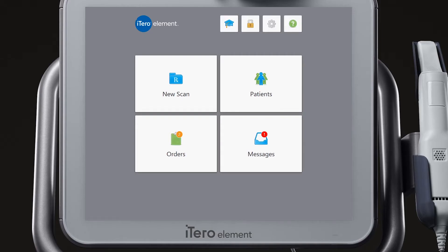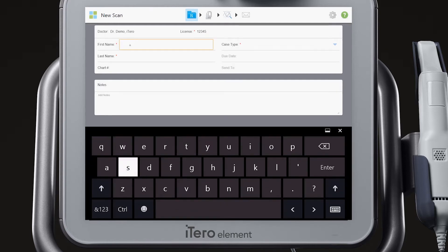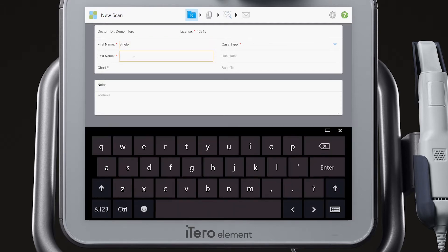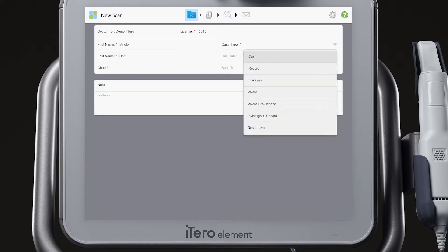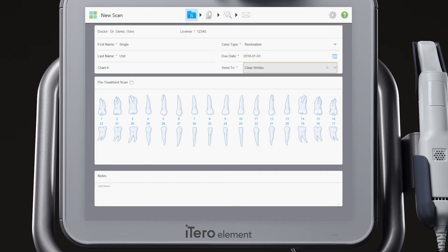Select New Scan from the home screen. Complete the required information in the Rx: patient's first and last name, case type, due date, and the lab the case will be sent to. The required items are identified by the red asterisk.